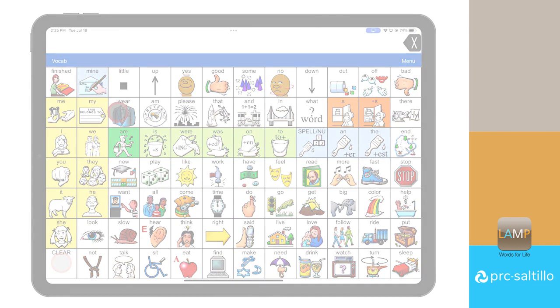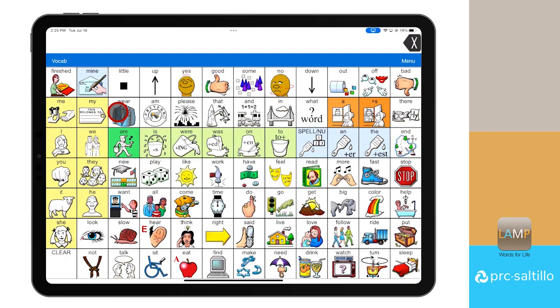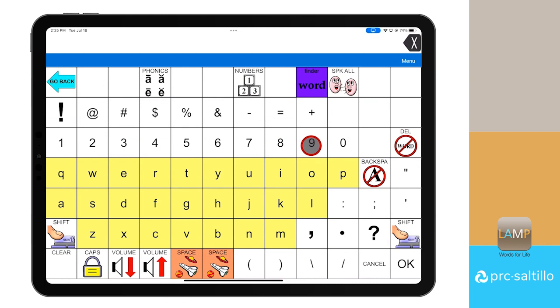There are two ways to get to WordFinder within the Lamp Words for Life app. One way is through the spelling and numbers page. Once there, select WordFinder in the top row.